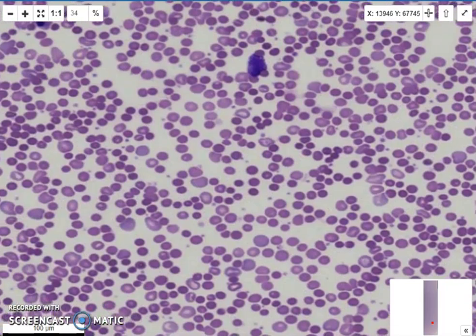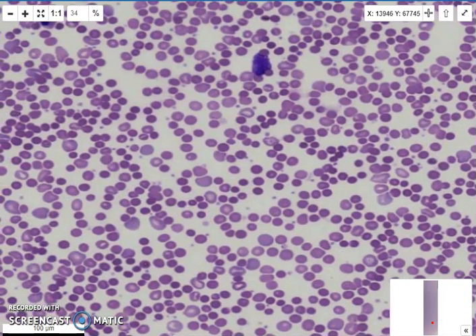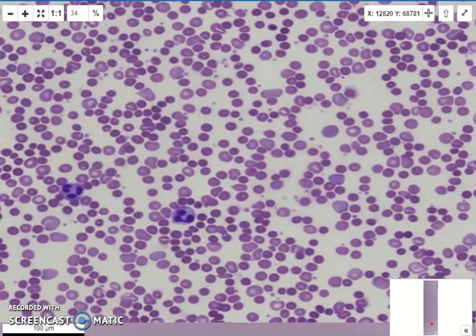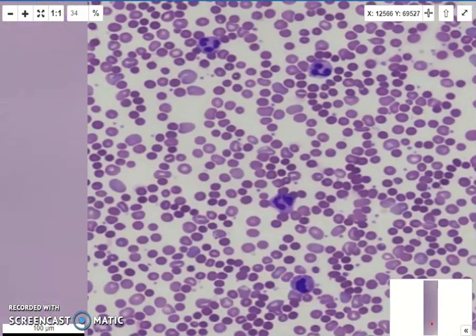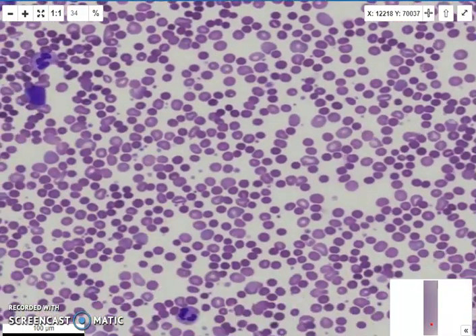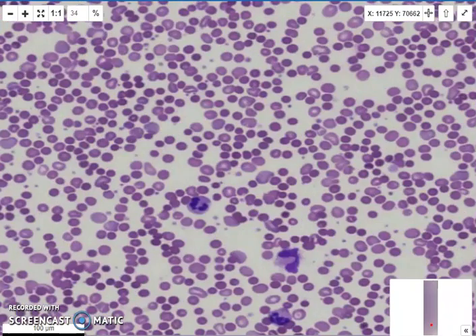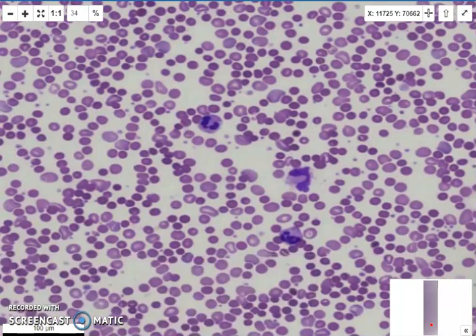So if I get a slide and my prominent poikilocyte is spherocytes, I'm going to think about hereditary spherocytosis versus autoimmune. I'm going to judge that on my degree of hemolysis and the amount of nucleated red blood cells that I see. I might also look at the mushroom cells. I'm not seeing mushroom cells here. They are all round, small spherocytes.